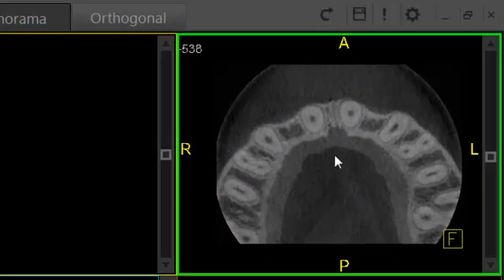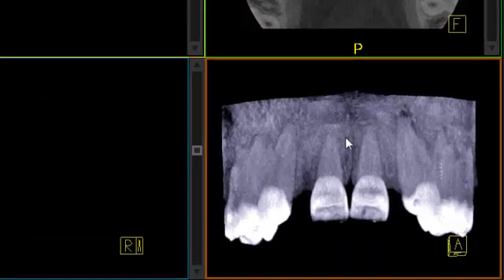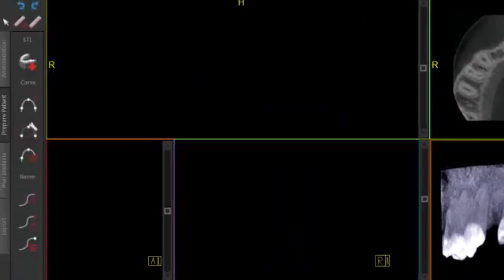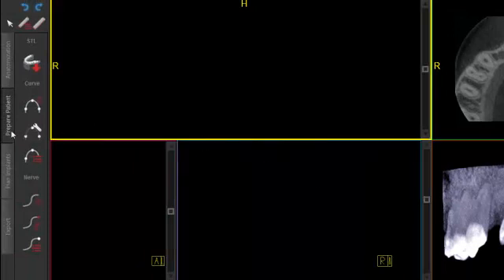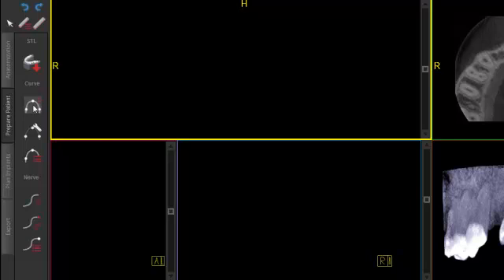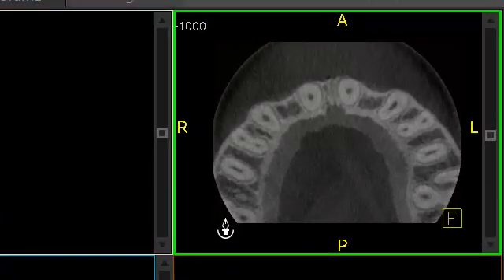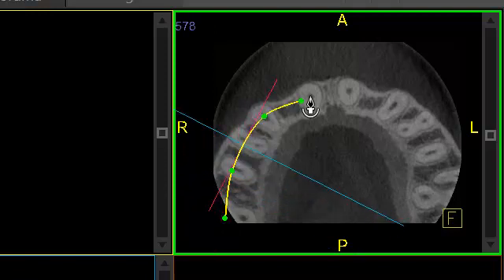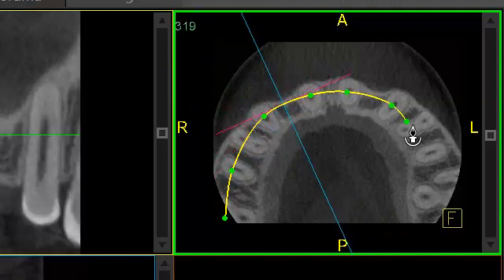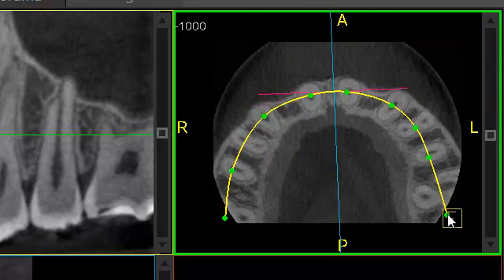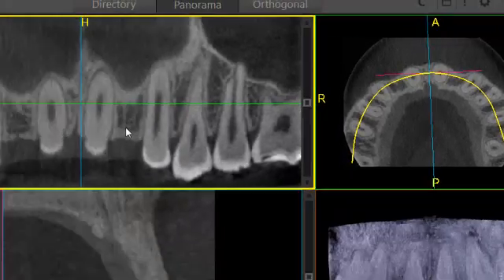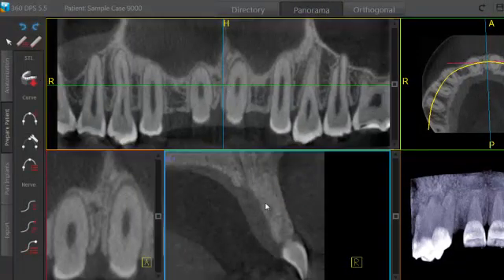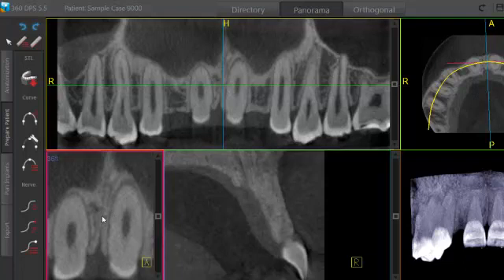You can see to begin we have our axial view here to the top right and our 3D volume rendering down below. The software starts us here in the prepare patient tab where we have our curve drawing tool. I am going to go ahead and select that curve tool and then very easily take my cursor and use it to draw my curve through my maxillary teeth here. Double click to finish and you can see now we have our pan, our cross section, and then our transaxial view, which we will all use to plan the implant placement.